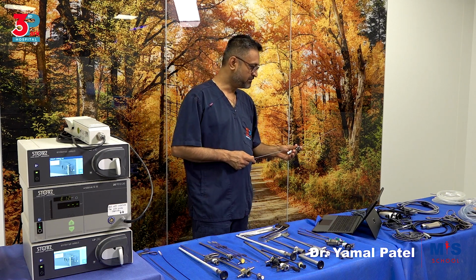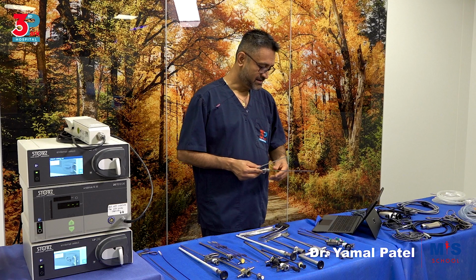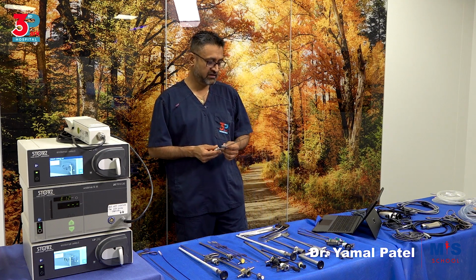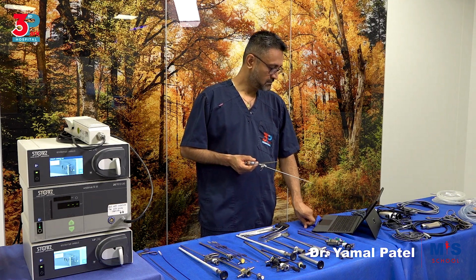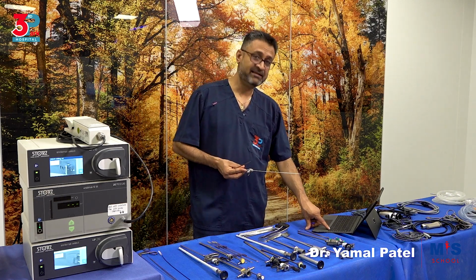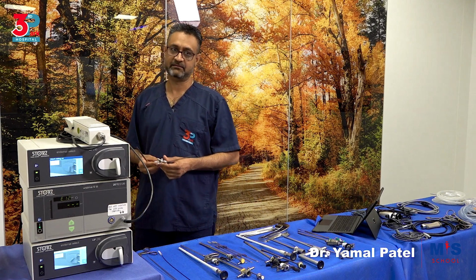Hysteroscopy is derived from the Greek words hystros, which is uterus, and scopy, which is to look. So it is to look into the uterus. It can be used for diagnostic and therapeutic purposes. It is used for a number of procedures. We'll go into that, but today our focus is mainly on the equipment and the setup.